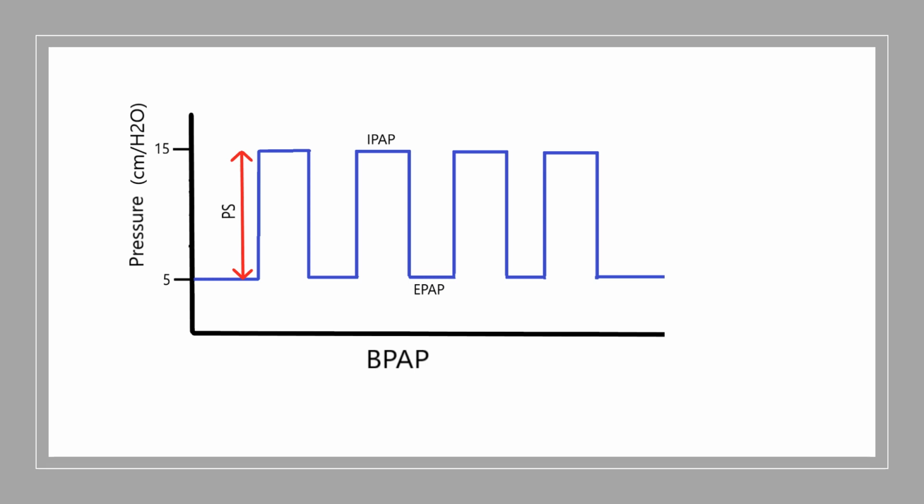So it's important to know that because when we're making these settings and titrations, we need to know how much we're going up by, because that's going to make a huge difference in the amount of work of breathing that we are reducing in the patient.